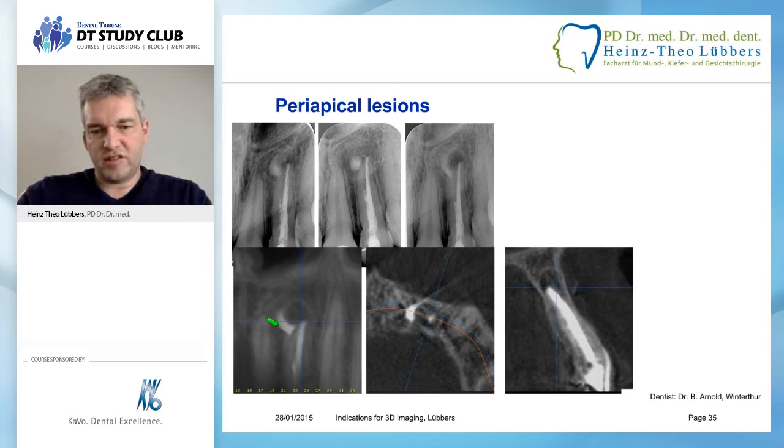It's as simple as some sealer that is here in a periapical lesion, and I really wonder how these changes here could happen, because it's always the same tooth, the same situation, the same image. But it's, in my belief, just due to some angle issues with the dental film, because I won't believe that a sealer in the bone here would change its structure from this to this to this. That doesn't seem logical to me.